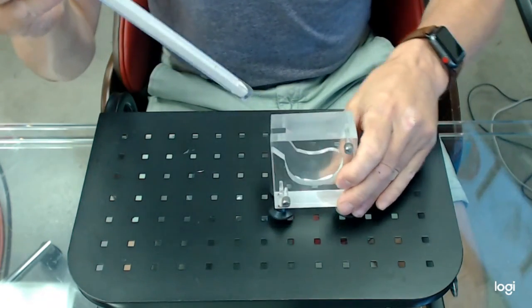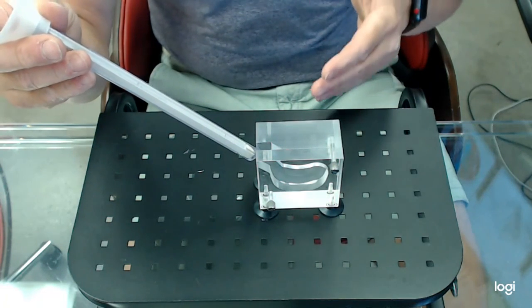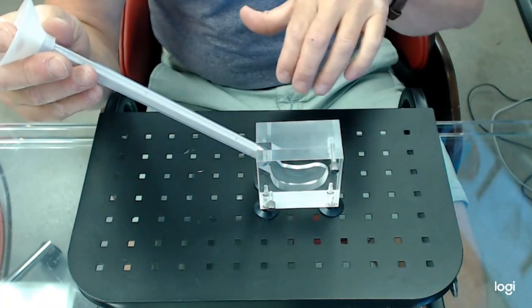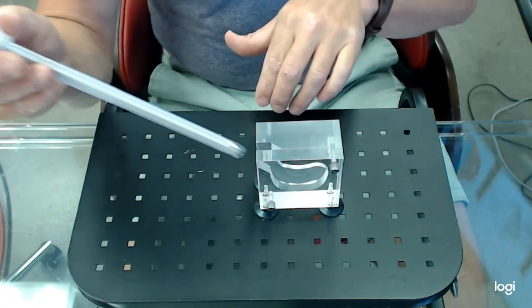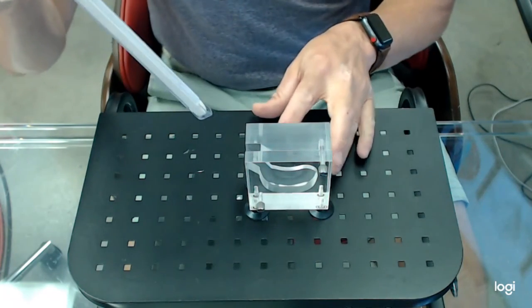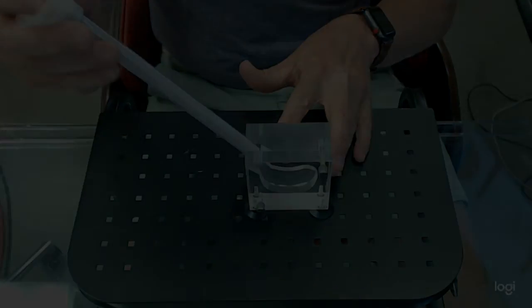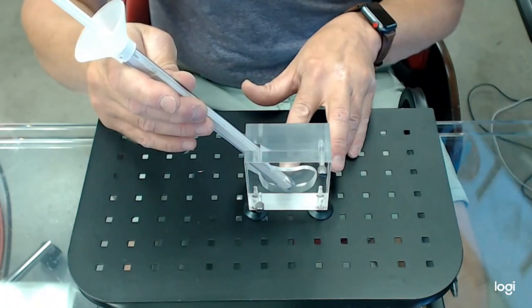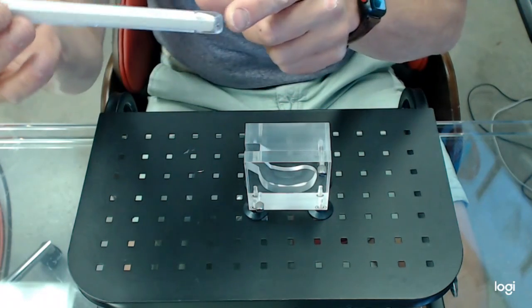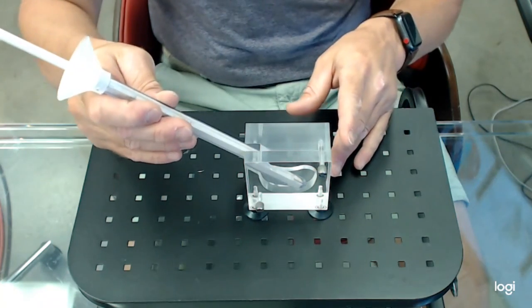So when the doctor has already done the removal of the hemilamina and the medial facet, and all the disc has been cleared out, and he or she is ready to put the interbody in, remember, some of this bone can be placed into the interbody itself, like in the video. And what they'll do is insert the funnel, and they'll go right through the box annulotomy that was created. Obviously, you don't want to push too hard here because the big red is back there. But there is a marker on the very tip that is radio opaque. So if they do a fluoro, they can see that they're in there, but they don't have to.